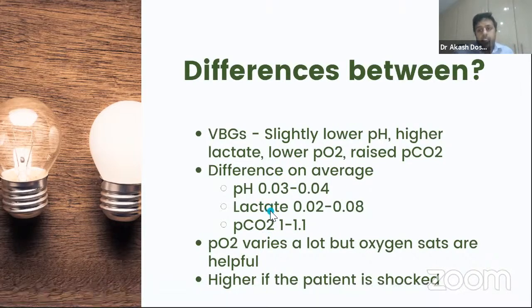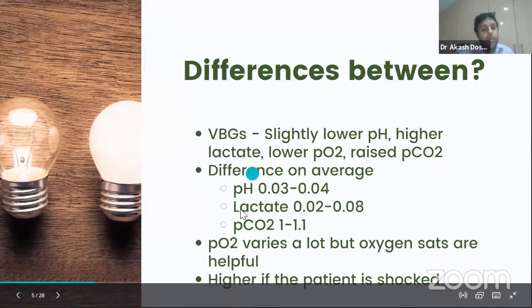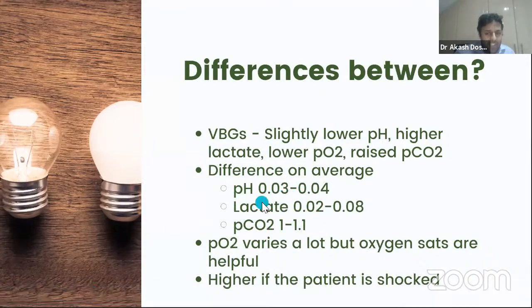The reason being is if you're unwell, you're going to be essentially going through more metabolism, more shock, more lactate, more anaerobic respiration, which means that these differences are a bit more. But as you can see, the differences are very minute.